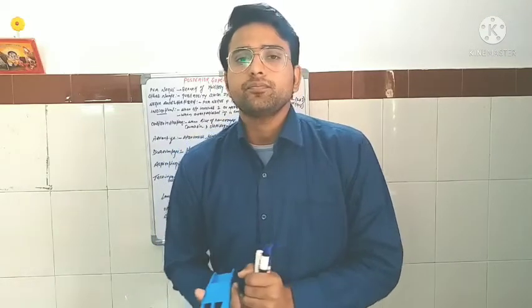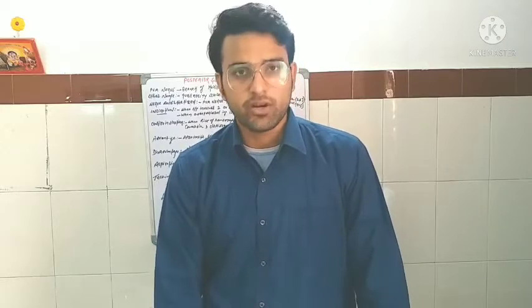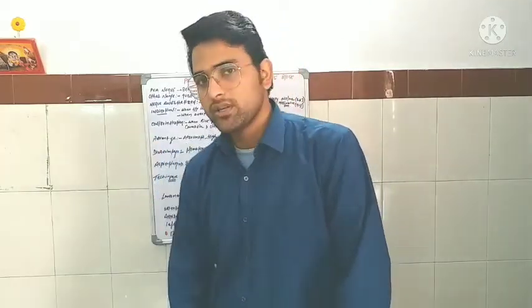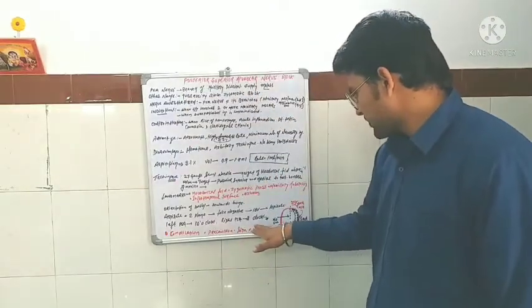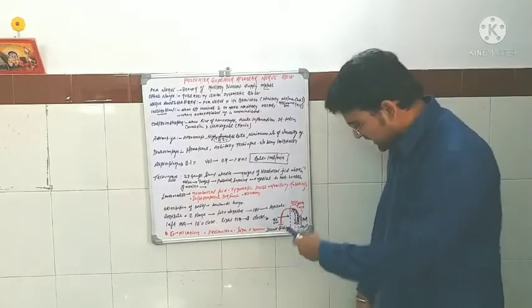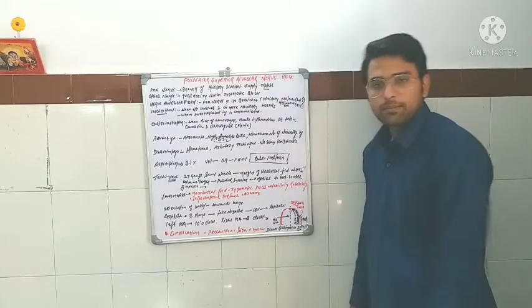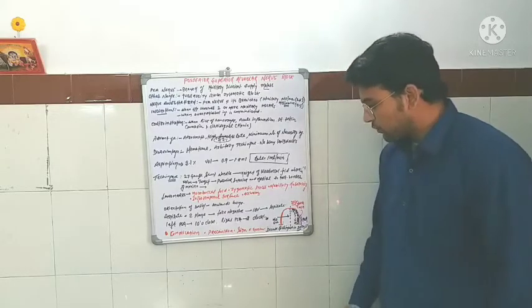Then, after reaching the right position, how much amount will you inject there? That will be 0.9 to 1.8 ml. I have already written it like this. And see, this is the area where the PSA nerve block is supplying, the area up to the mesiobuccal root.